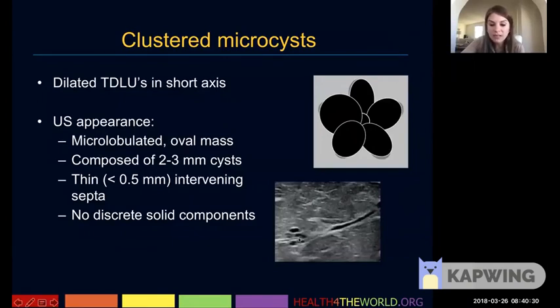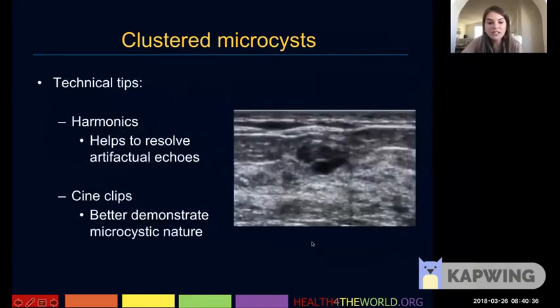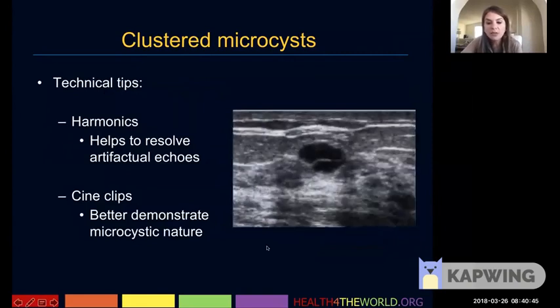So here you see a beautiful example, this duct kind of leading up to these clustered microcysts. Here's another example. This one was a little less obvious. We were wondering, could this possibly be a solid component? We put on harmonics. It really clears that up.